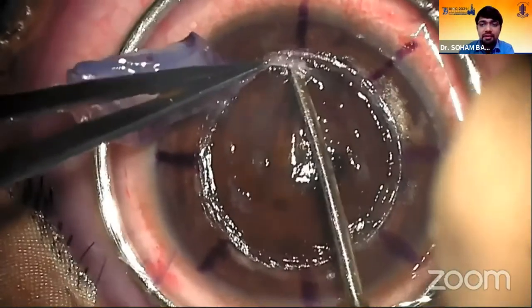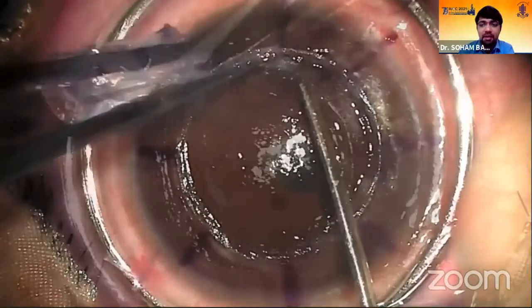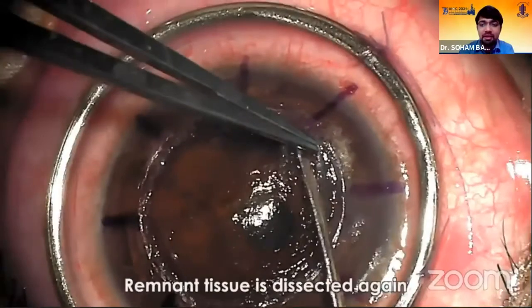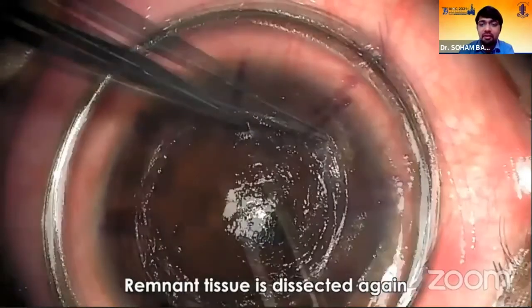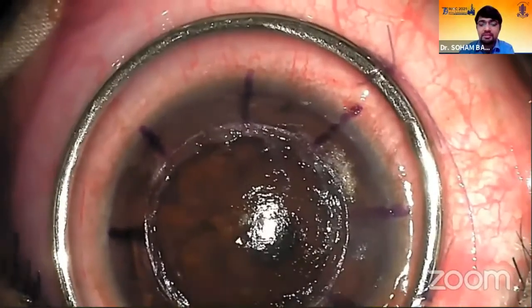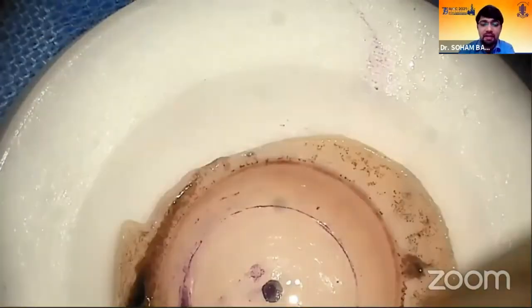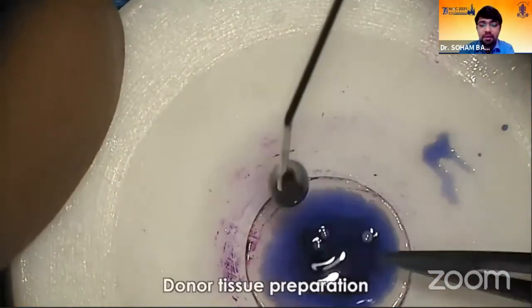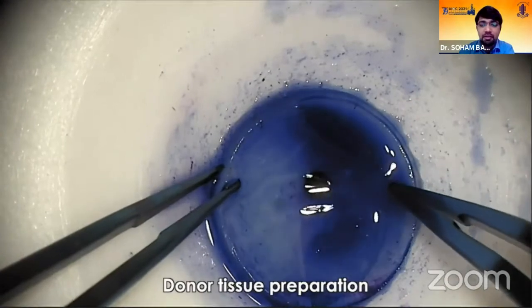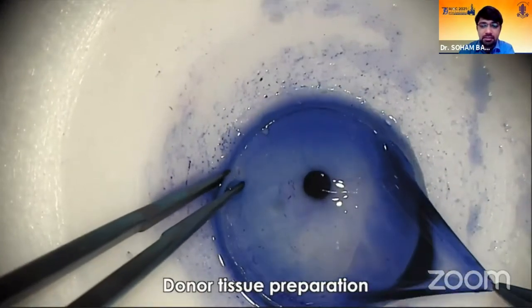And any peripheral tissue that you are unhappy with can be dissected at this point of time. However, it does not matter much in the long run, even if you have maybe 100 microns in the periphery, the clinical outcome doesn't really change as long as your central 5 millimeters are really well dissected. Graft preparation, you stain with trypan blue and gently peel off the DM endothelium complex.